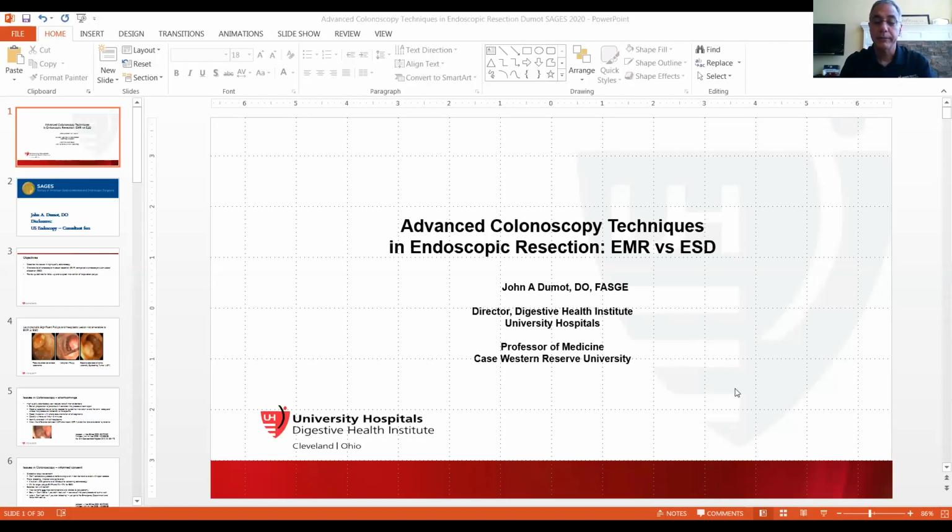I would like to thank Lena Katan and the SAGES committee for allowing me to share with you some ideas and thoughts on endoscopic resection. Today, we're going to discuss the difference between EMR and ESD and how it may apply to your practices.